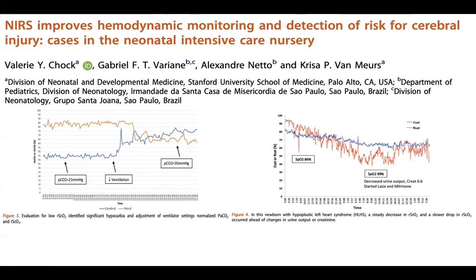An example that I want to give you is a patient who is on aEEG and cerebral saturation monitoring and is under therapeutic hypothermia. If you see your CSAT suddenly drop, it could be because the baby is seizing. And so you look back at your aEEG, which is sometimes more subtle, and then finally you might see the seizure appearing. So it may be a good monitoring tool to add to your arsenal of different elements, a kind of new vital sign to monitor some of these critically ill newborns.